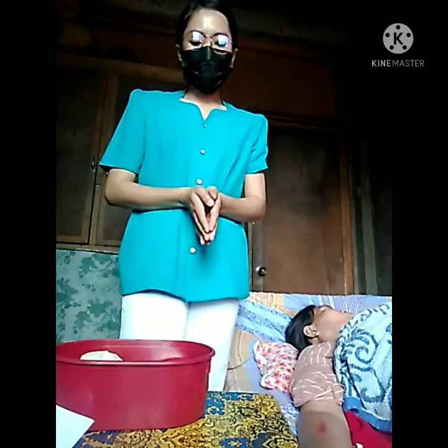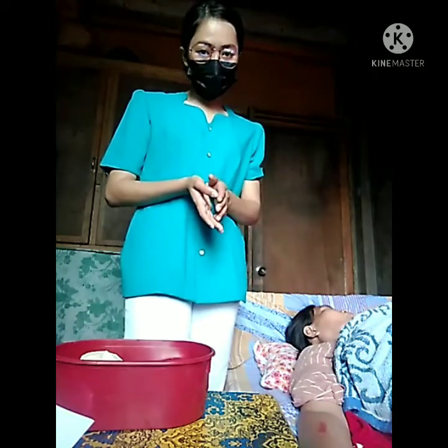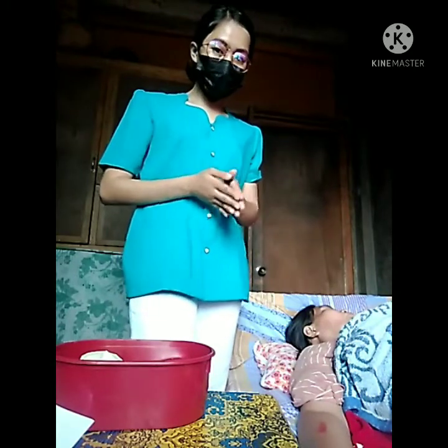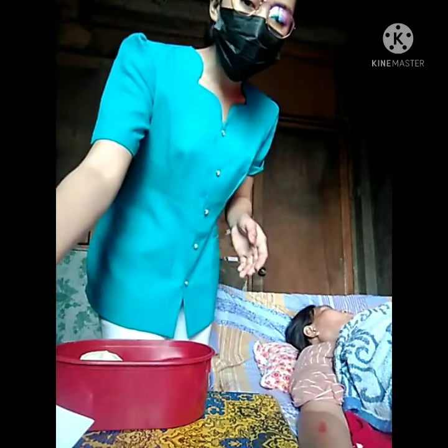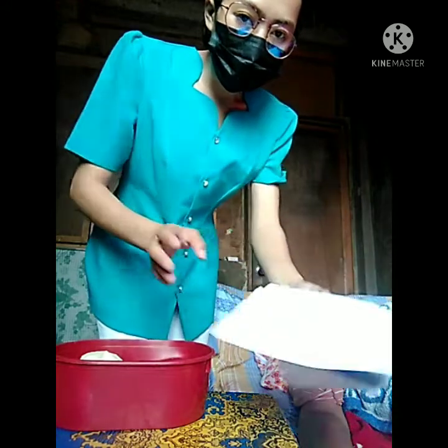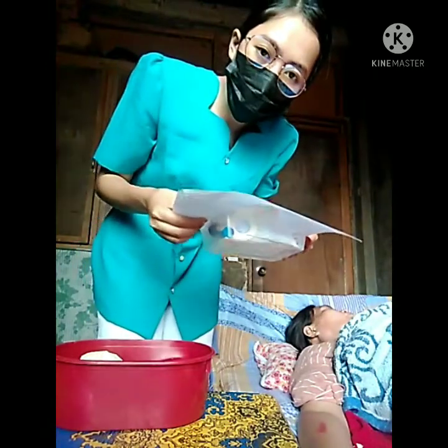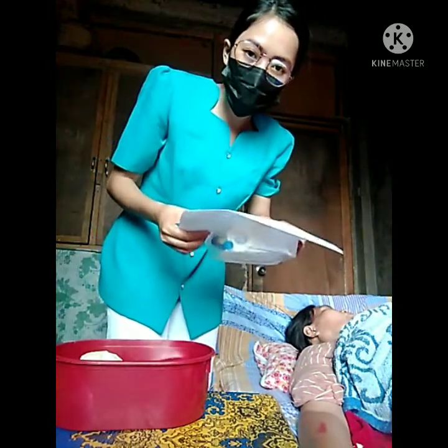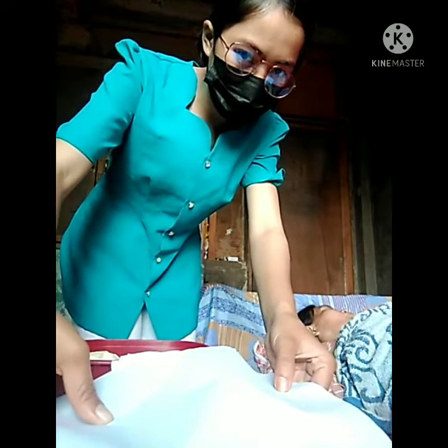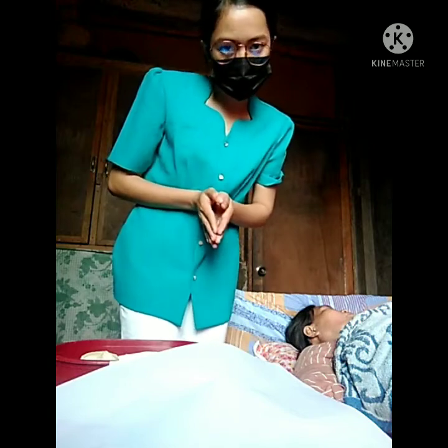The next step is to open the sterile dressing tray or individually wrapped sterile supplies, and then place them on the bedside or on the work area. So this is my dressing sterile supplies. I need to put it here on the bedside. And then next is to apply the dressing.